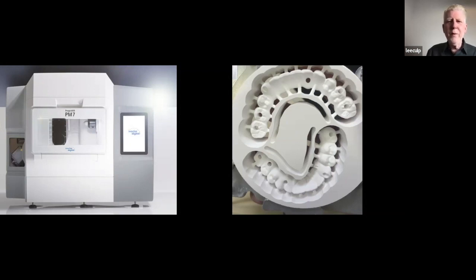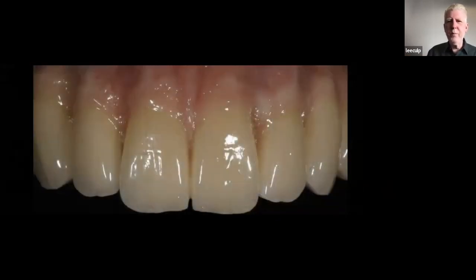A lot of it was because of what we do here in the laboratory, which is full arch on implant. That's our number one product here at the laboratory. And it's not a whole lot different. Whether we're doing crown and bridge that goes on implants or dentures, the workflow is almost exactly the same. We're almost really creating a denture with teeth and tissue that just attaches to implants. So there's not a whole lot of difference between the 2 workflows, and we were able to figure this out pretty quickly.